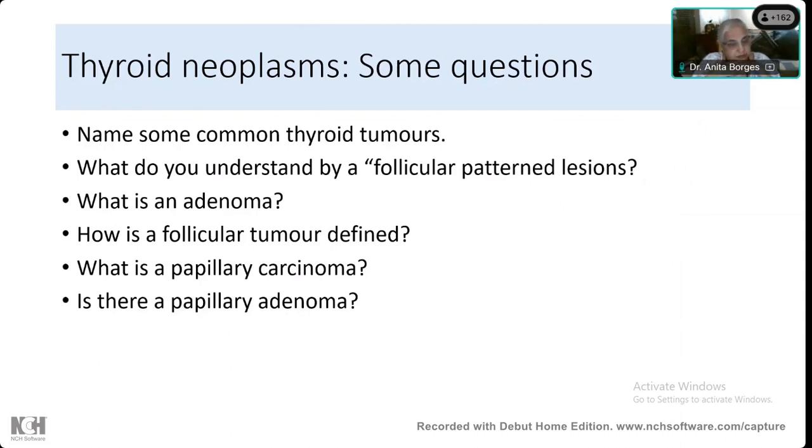No? Anybody else want to answer? Rushali? Anything that has some material inside, and epithelial cells arranged around it, like colloid. Okay. What is the material inside a lymphoid follicle? Is there a cavity in a lymphoid follicle? You've heard of a lymphoid follicle, Rushali? You've seen one? You think there's something inside it, Rushali?